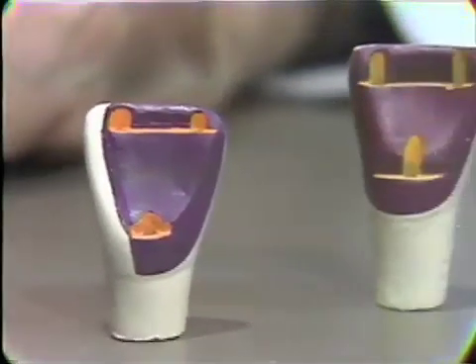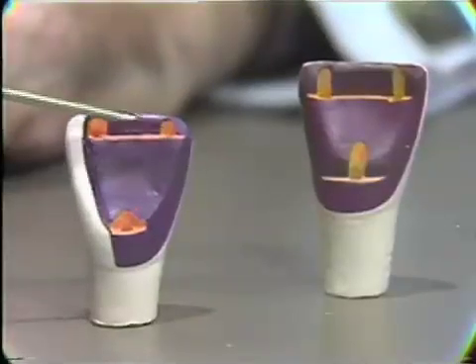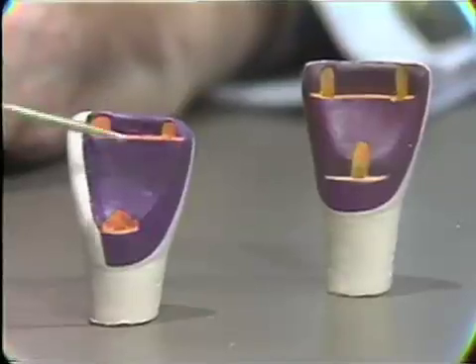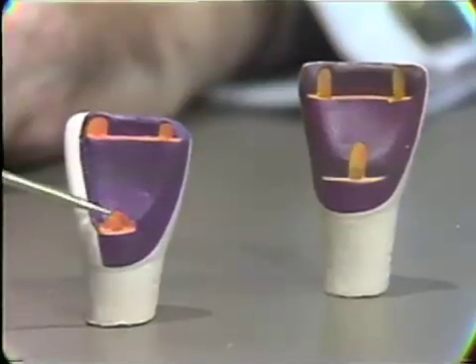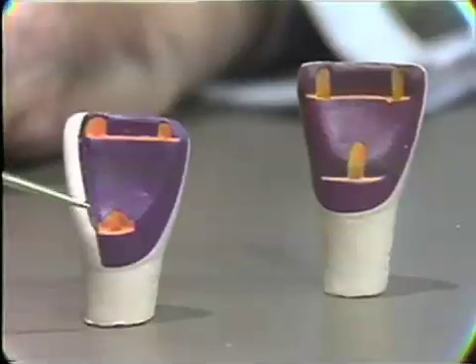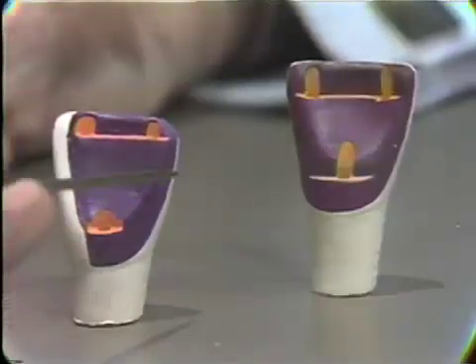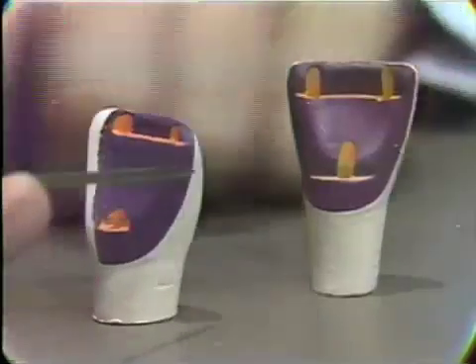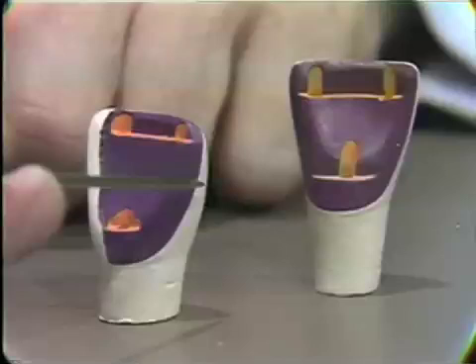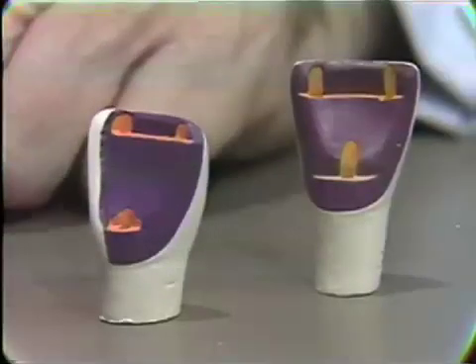The retention in these cases, as we have said, is gained by 3 pins on the lingual placed in these recesses on either end of the incisal ledge here and in the cingulum ledge down in this situation, and these give the necessary retention, so that the position of the proximal slice here can be modified, can be controlled according to aesthetics, in contrast to the three-quarter crown, where you remember it had to be extended to include the area of the proximal groove.